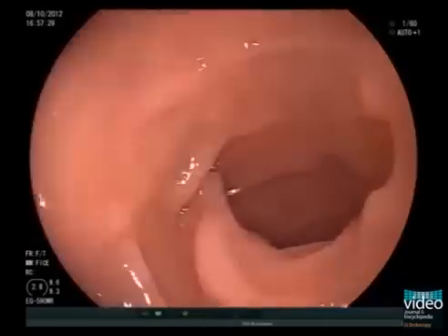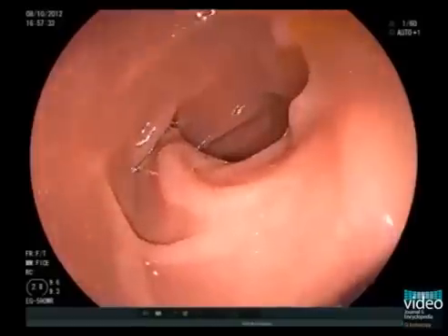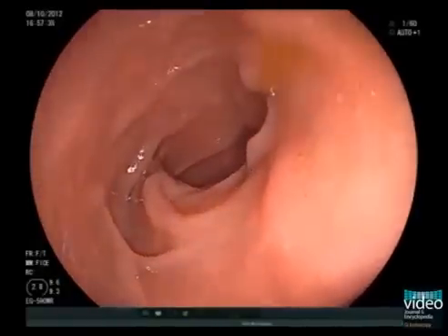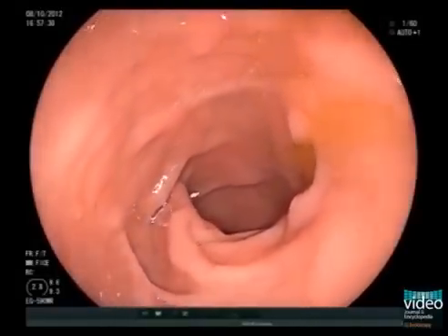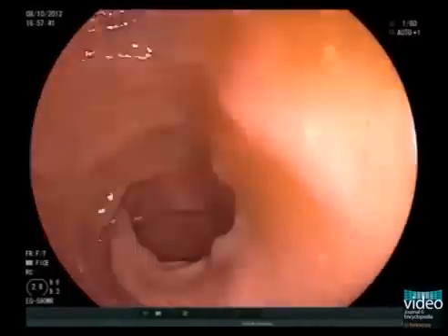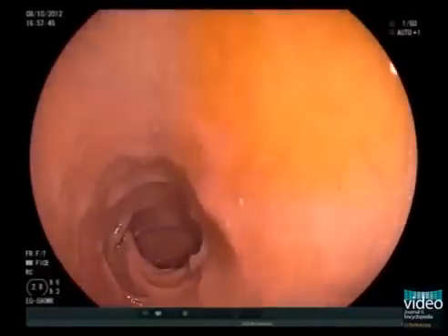After the proximal bulb has been entered by the pyloric channel, stop and wait until sufficient air has been given to inflate the bulb. Inspection of the bulb is carried out using advancing and withdrawing movements. At this stage, the scope may often return into the gastric cavity.